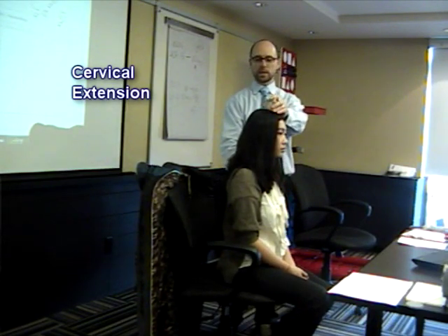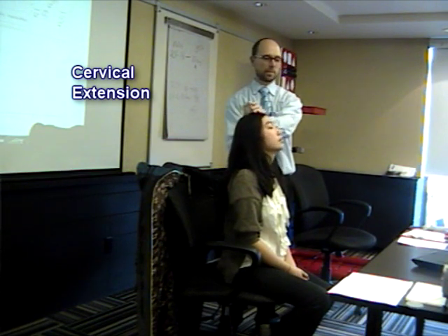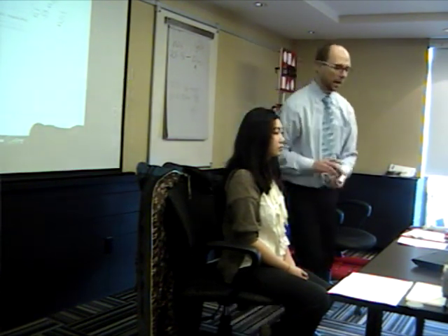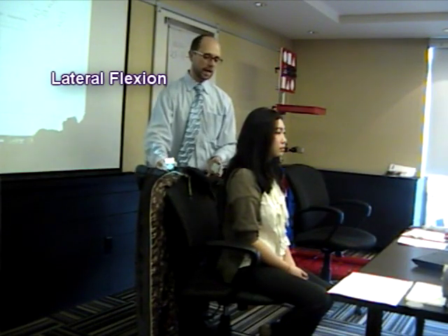I would reset myself to zero again. Come into extension for me. I would record my scores and I would come over here to do the side flexion.